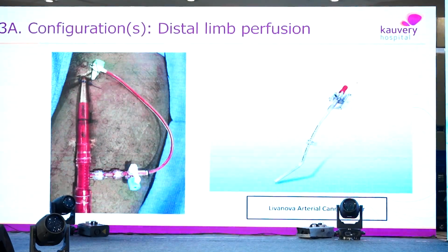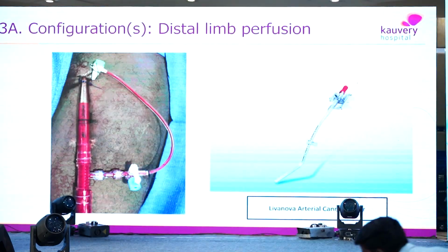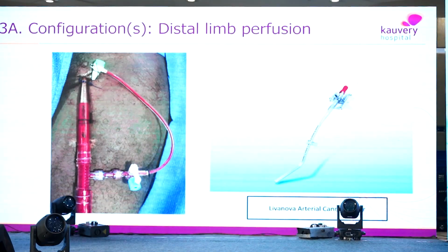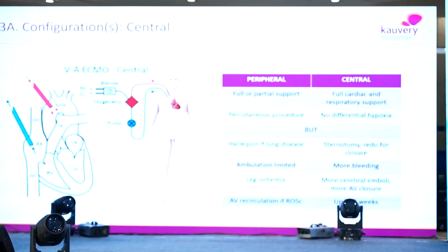So what this also means is that if it is a planned procedure, then you can use this cannula, because we require radiographic positioning. So most of our elective, semi-elective VA ECMOs, we now do in the hybrid cath lab where we have access to fluoroscopy and access to ultrasound. But if you have a crash and burn situation, then use bedside ultrasound and bedside TEE, which I will show you next.